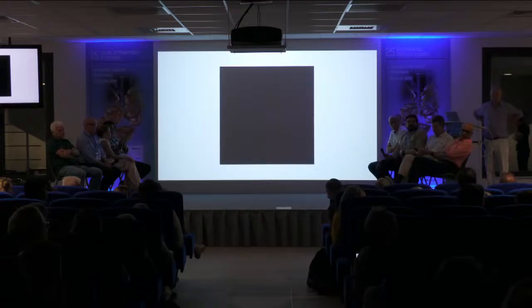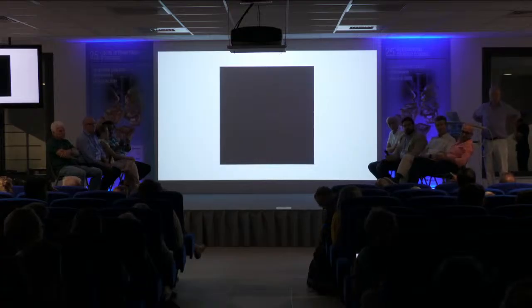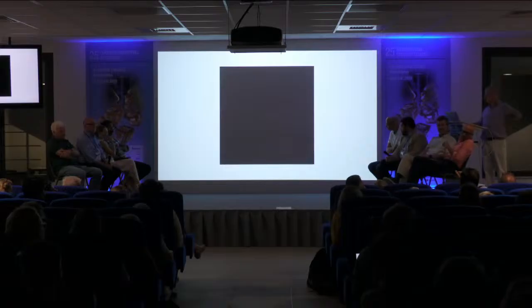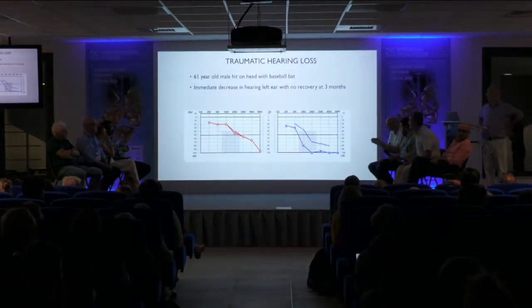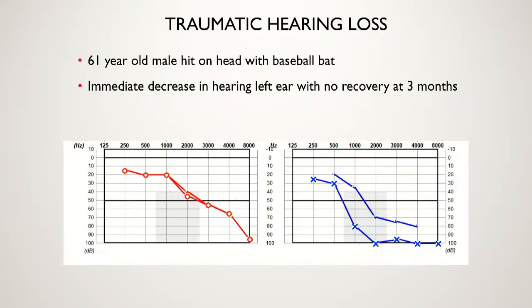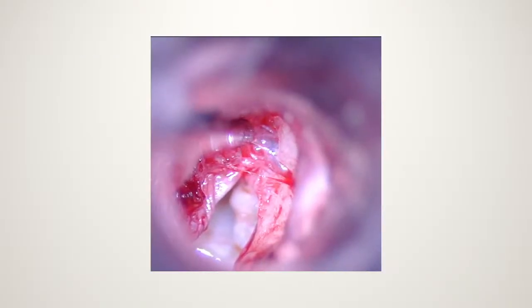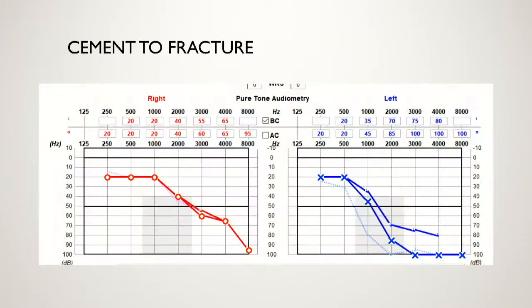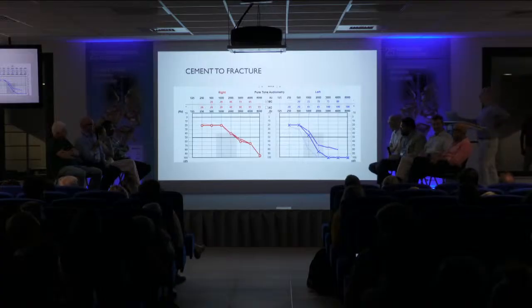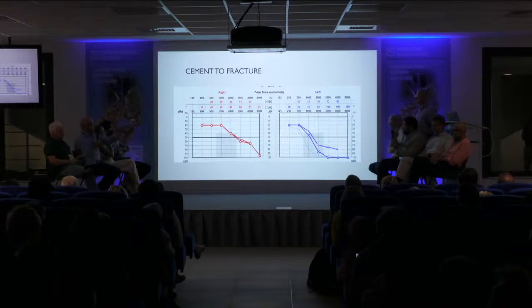In this case, the patient has a mixed hearing loss, and the bone thresholds are... Well, he's 61, so he's got age-related loss. But even if you have a very good result, he'll still have to use the hearing aid, right? So I think it's a very good indication for a Soundbridge on the stapes head.